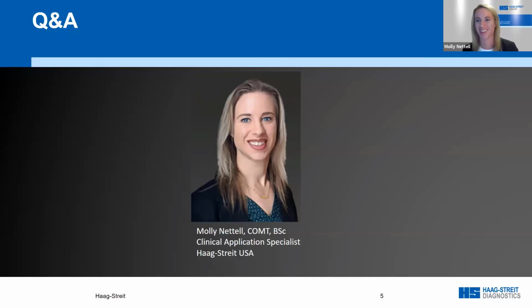It's raining. No problem. So Molly, the first question was, do the trial lenses provided with the Octopus 600 correct for astigmatism? They do not. The trial lenses that come with your 600 are those blue spherical equivalent trial lenses that just pop directly into the instrument. Like I said, they're 1 diopter spherical increments. Your Octopus is going to recommend using those up to 1 diopter of astigmatism. After that, it's going to recommend an alternative method.